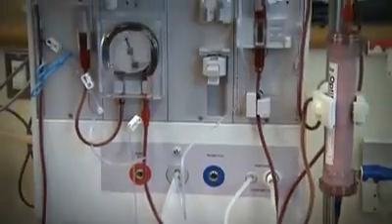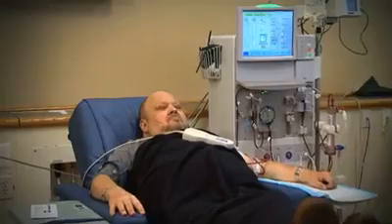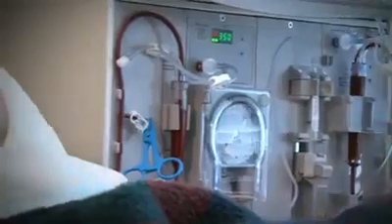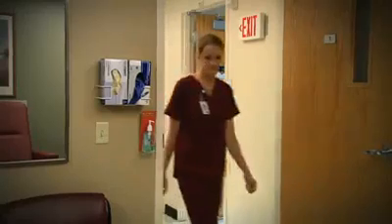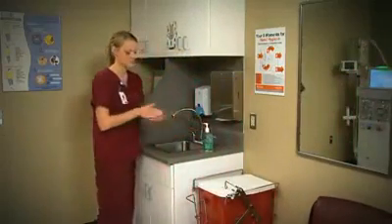When initiating dialysis with a catheter, medical professionals must follow recommended infection prevention guidelines. Doing so can reduce the rate of central line-associated bloodstream infections, decrease hospital costs, and, most importantly, improve clinical care. Hand hygiene is the first vital step to initiating dialysis with a catheter and is a primary factor in reducing infections in the dialysis center.